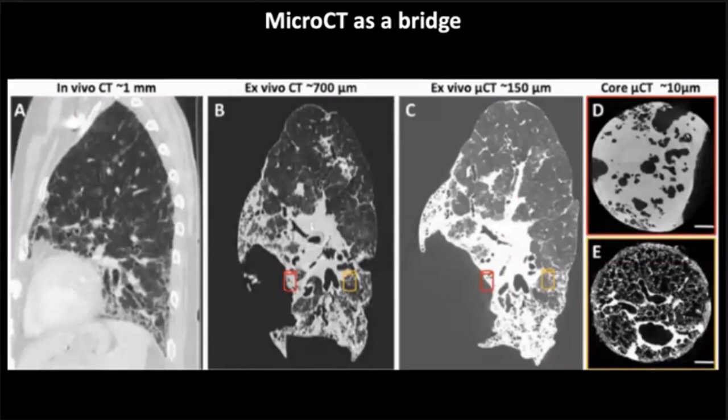What we then do is physically extract different cores out of this lung. We slice up the lung and take tissue cores, illustrated by the red circle and the red cylinder here and the yellow cylinder here. This is an area with extensive fibrosis. It's very white, so it's very dense material. This is very interesting in the lung: the disease is very heterogeneous. Within the same lung, almost at the same level, you see areas which are minimally affected, and here at the top of the lung, there are even areas that are almost not affected. This is what we leverage to learn more about lung disease, but also about lung changes in healthy aging, in fibrosis, and in different types of pulmonary diseases.